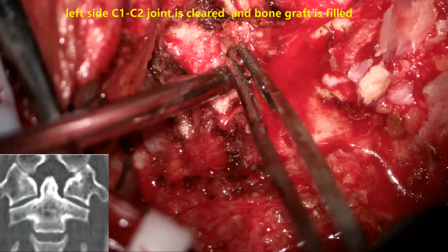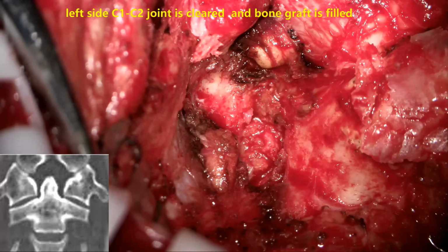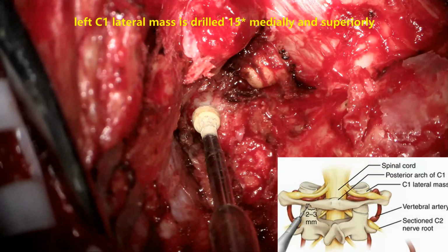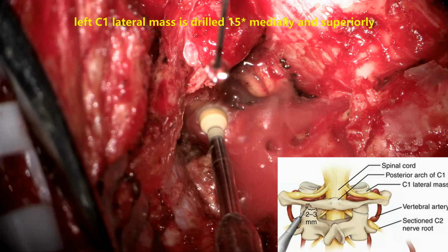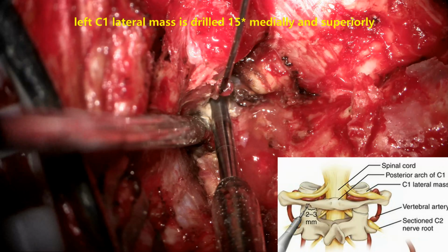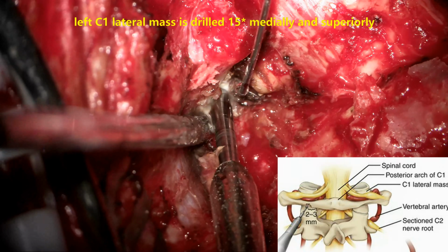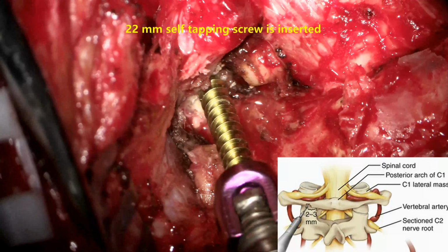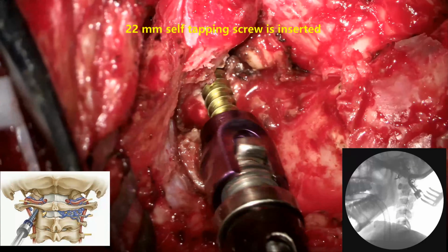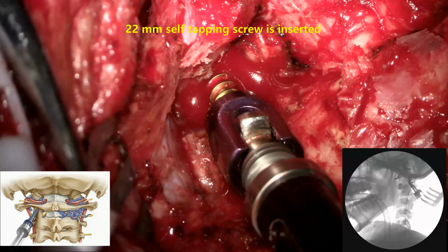Once that is done, a similar procedure again we conduct. With a 1 millimeter diamond drill, the inferior part of the lateral mass of the facet joint, central part, is drilled 15 degrees medially and superiorly. That is the correct direction where we enter the lateral mass of the C1 arch. This fact needs to be kept in mind, and we drill quite deeper. If the drilling is good, you don't have to use the tap in these cases. Again, a 22 millimeter self-tapping screw is inserted.